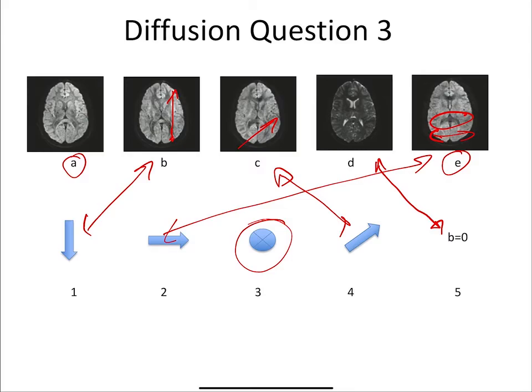Yes. So in these images, where we can see this is within the CSF, but for the b equals 0, there's a lot of variety between the images for the CSF, right? You mean for D? Across all of them. Actually, the dark spots in the other ones are in white matter. Yeah, so it is sort of tricky as you're looking at these images. If there is diffusion weighting applied, then most of the differences will occur along the white matter tracts.